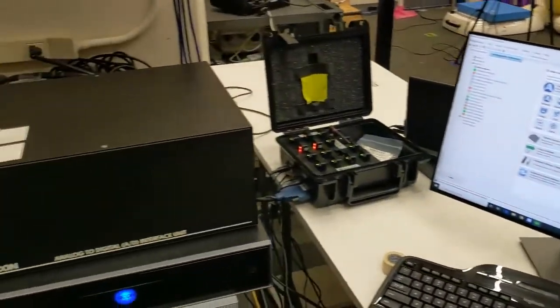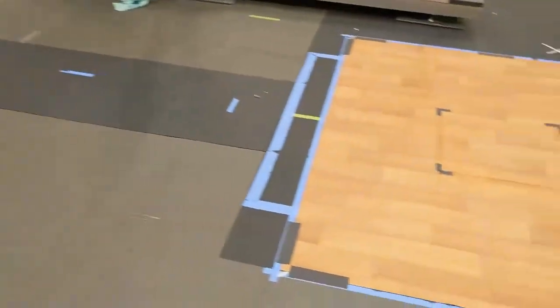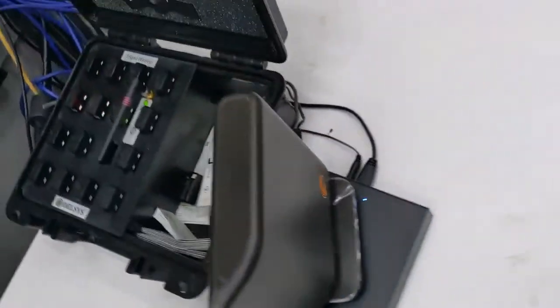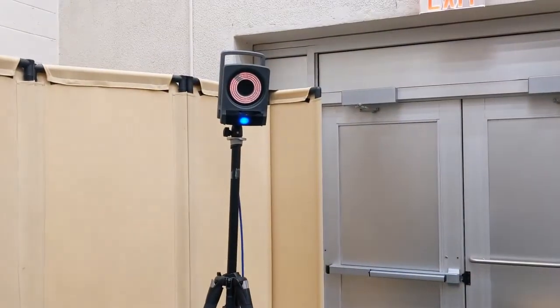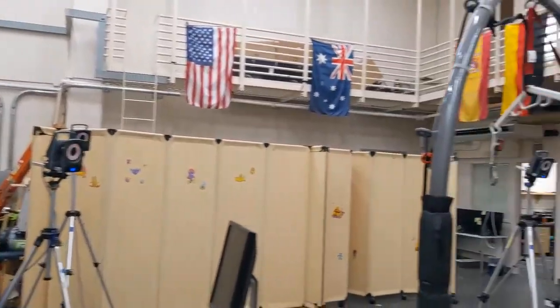After starting and calibrating the cameras and force plates, our team will need to take anthropometric measures such as shank and thigh length and ankle and knee width of our subject. We will then apply reflective markers that are picked up by 3D motion capture cameras. The subject will perform walking trials where we will gather the raw data, including ground reaction forces and the 3D video, which will display the reflective markers.